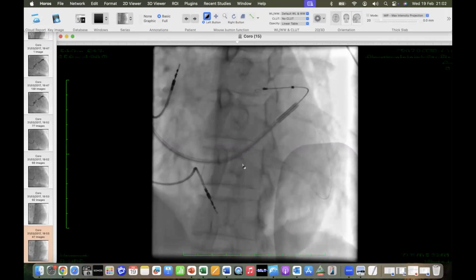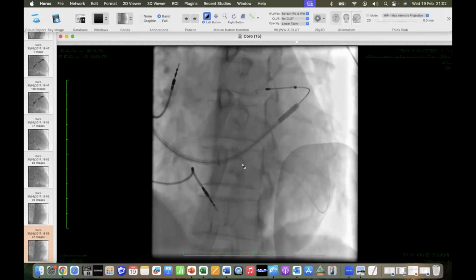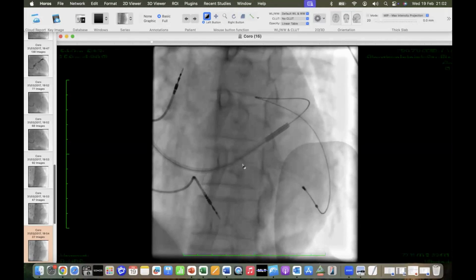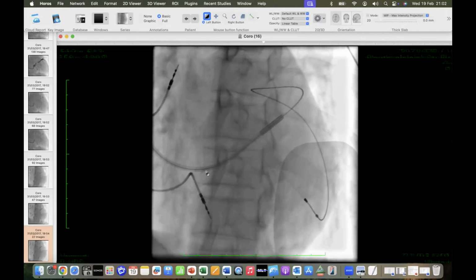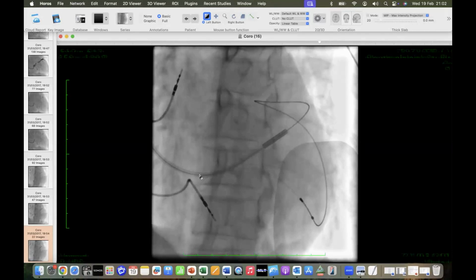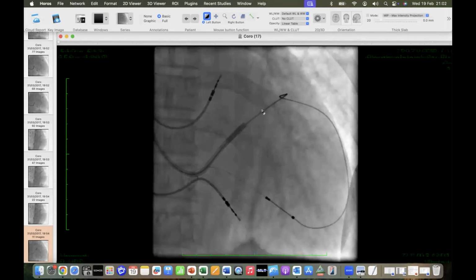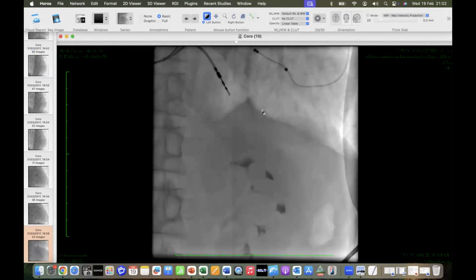I don't know if you can see the guide wire clearly because it's clear to me, but I know it's very tiny. Can you see that, Hasham? Yeah, we can. Yeah. You can see it now coming out from the coronary sinus nearly. Yeah, it's out. It's basically in the body of the coronary sinus, and using that very deep-seated position, we're able to put this LV lead into a position. I think I saved this just for teaching purposes, and eventually that was our final position.